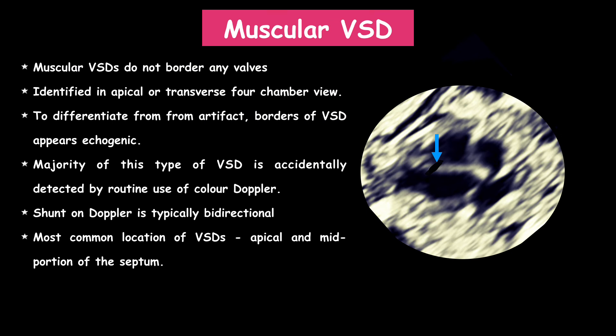Now let's see the last type: muscular VSD. These do not have any valves as their borders. They can be identified in the apical and transverse four-chamber views. To differentiate from artifact, the borders of the VSD will generally appear echogenic. The majority of the time, this type of VSD is accidentally detected by routine use of color Doppler. The shunt on Doppler is typically bidirectional. The most common locations are apical and in the mid portion of the septum.